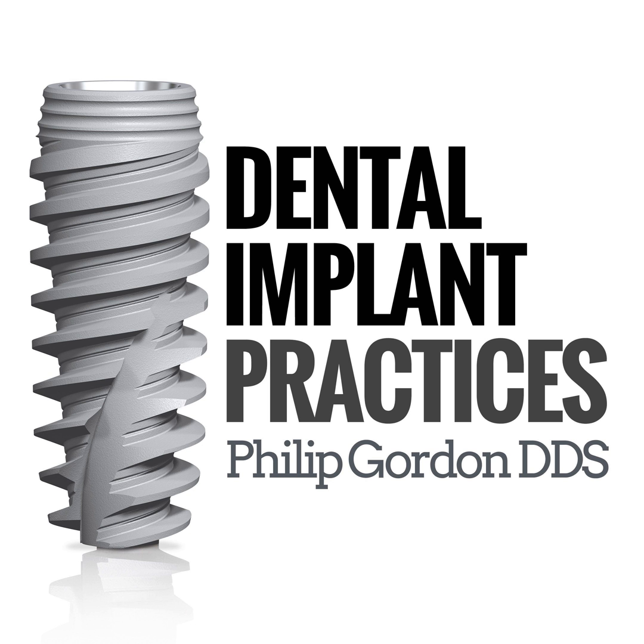So I said to her, I just took an implant course. I don't know if these things last 10 minutes or 10 years. You would be my first patient. I'll tell you what I'm willing to do. She was bilateral, had a good posterior ridge. She was missing number 18, 19, 20, and on the other side, the same, 31, 30, and 29. So she had a good ridge, and height to ridge looked pretty good. So I said, we'll try one side and see how it goes. I won't charge you for the implant, just for the bridge.